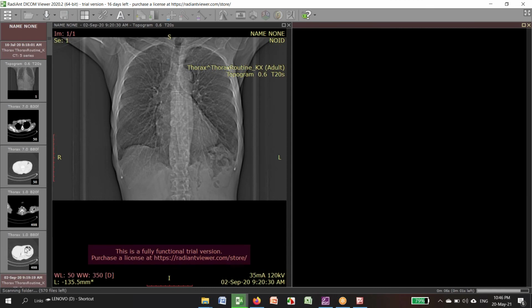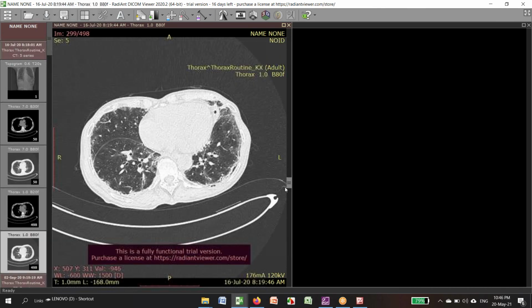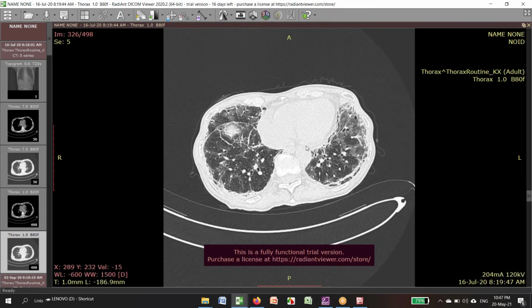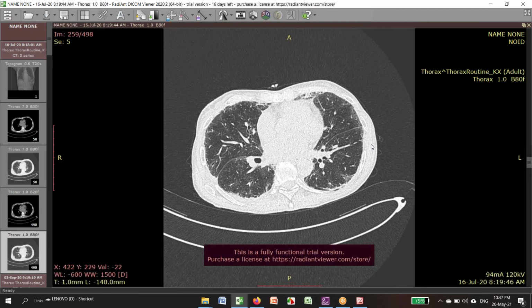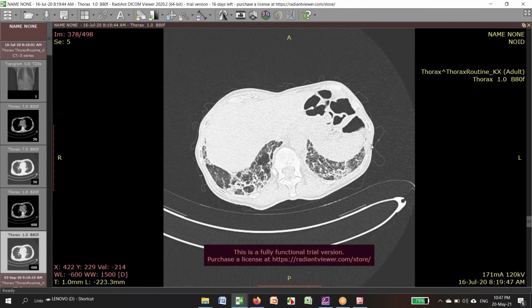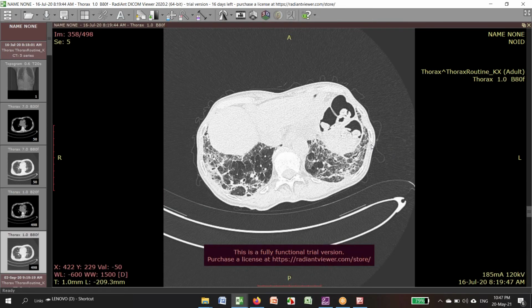It's not a COVID case. So just let me see. Yeah. It's a pretty typical, and if you agree, because you are the experts, and at least in my experience, not a very specific sign. So this is a lady. I'm going to withhold some history at the moment, and so you see that it has these areas of consolidation. I think that they form kind of a perilobular pattern at the bases.